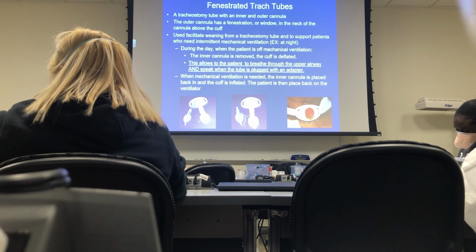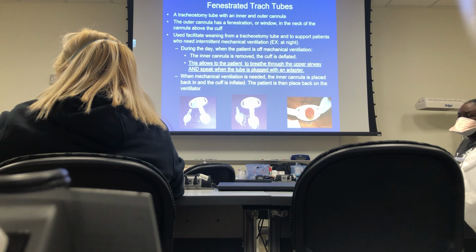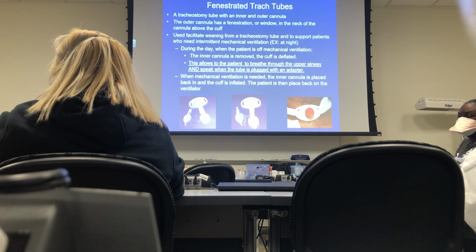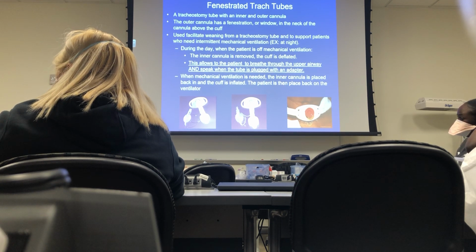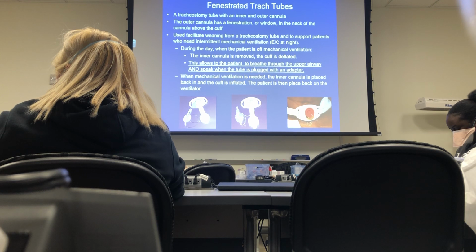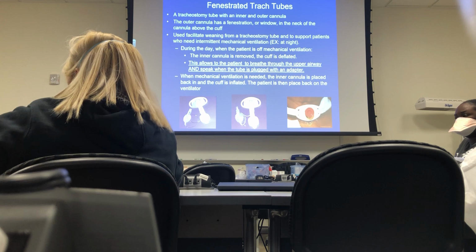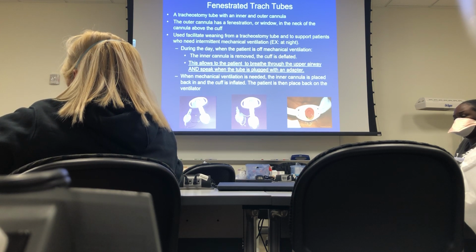Okay? Now, it can also be used on patients, okay? Here's the thing. Well, let me go through this. So you come in the morning, Jovi's had the patient all night long, and Patea comes in the morning, and he's going to put the patient on a nasal cannula. So he has to take the patient off the vent, and he has to plug the trach. All right? So he's looking at the patient. Patient's on the vent. He says, how am I going to do this? All right. So the first thing you want to do is suction the patient. Okay? So you suction the patient, get the airway all cleared out, suction out the mouth. Then, do you deflate the cuff before you put the plug on?